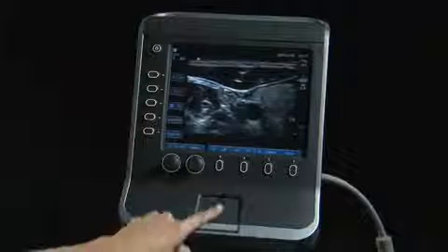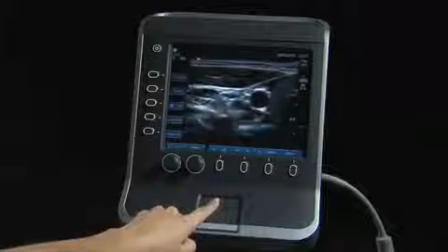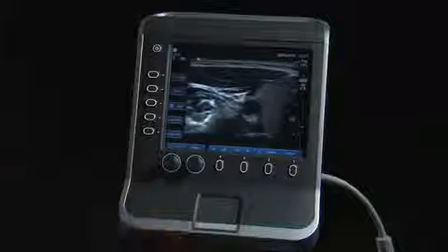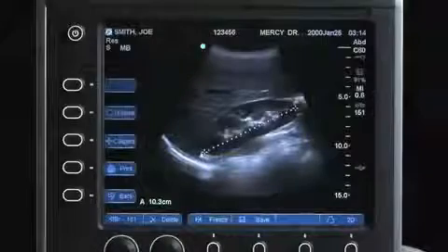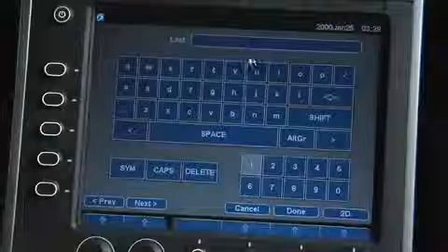In the lower middle of the control panel is the touchpad, which can be used to select, adjust, and move objects on the screen. The Select key is used to make various choices depending upon the function that is activated. It is used to switch between calipers for measurement, the zoom function, and the text forms.